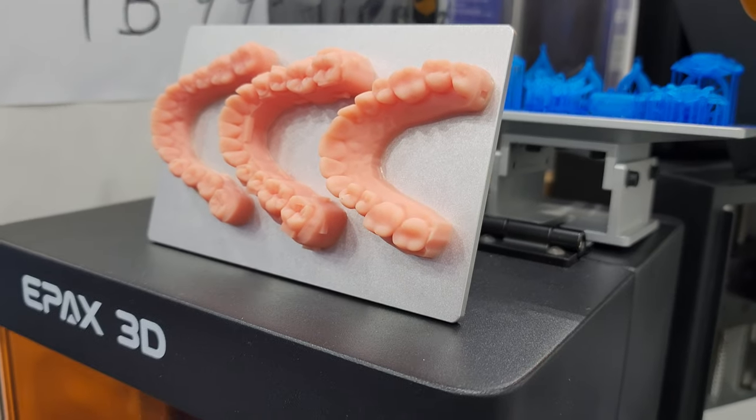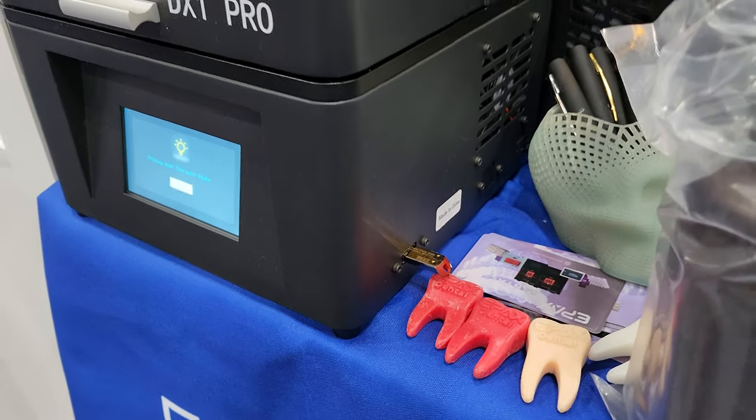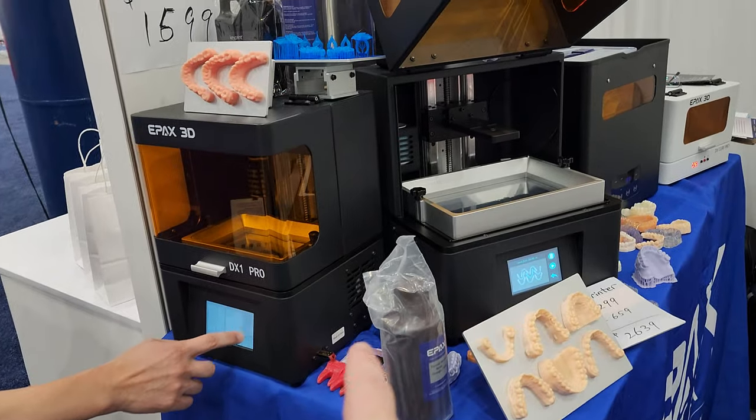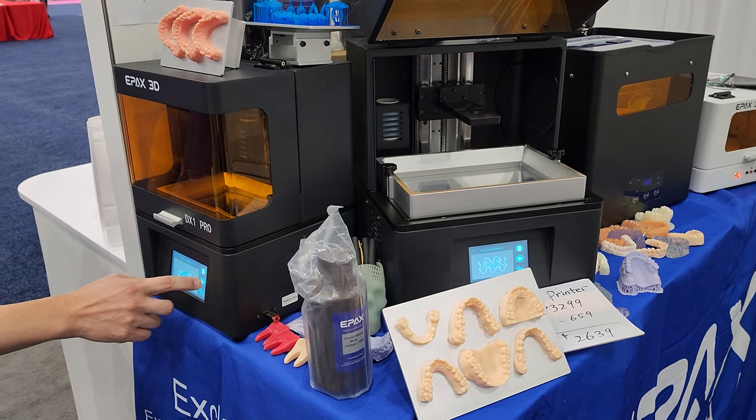So what you do is take the 3D scan and then import it. I can see down here there's a little USB stick. And can they also connect this to a computer? Yeah, you can use Ethernet, and right now they're working on a prototype to include Wi-Fi.